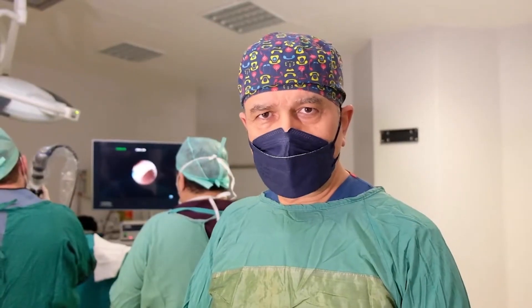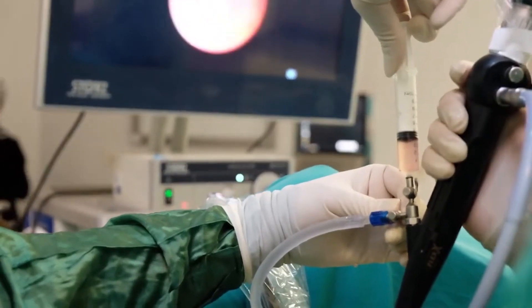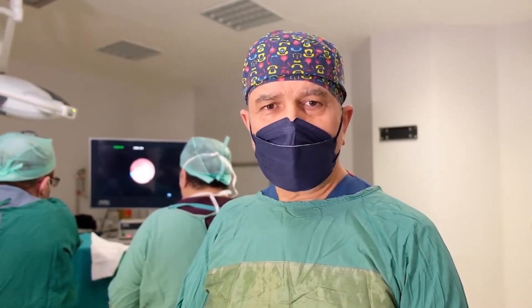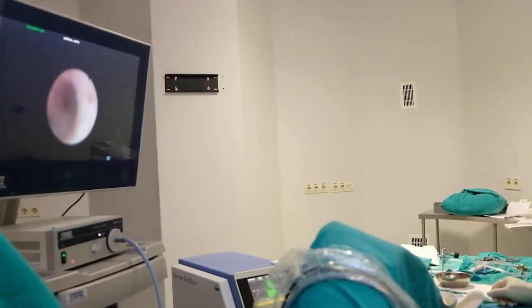We have planned this for this patient today and we are doing it under general anesthesia. Our procedure will take an average of 45 minutes. The patient is hospitalized overnight after the procedure, and we place a stent called a double J stent during the operation, which we will keep inside for one week to ten days. The procedure we will apply to our patient is limited to this.